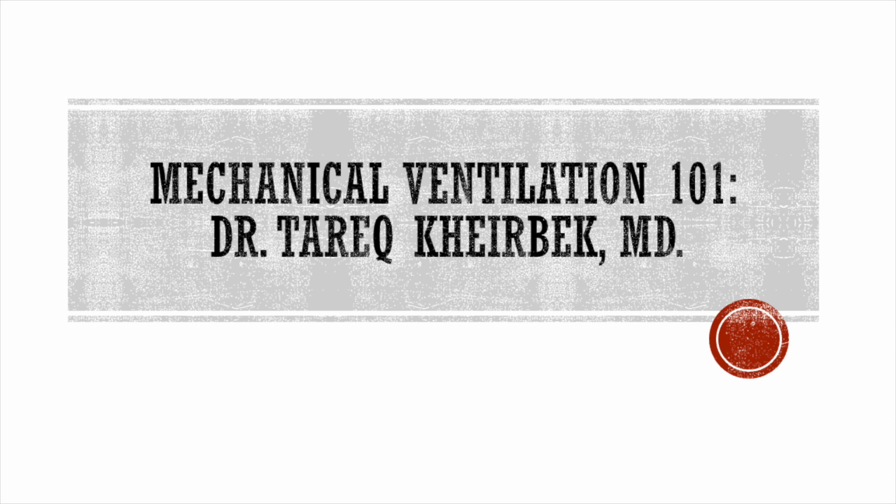In Rhode Island Hospital, we most commonly use pressure control ventilation. So I would use a pressure control ventilation with a PEEP of 5, FiO2 of 100%. And then as a start, I would do a pressure control between 12 to 16, monitoring the tidal volume and making sure it is within a safe range for the patient based on their gender and height. And I will match the respiratory rate to achieve a minute ventilation that I believe will match the patient's metabolic demand. And generally, that will be between 16 and 20 breaths a minute.